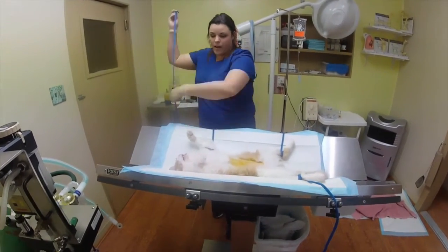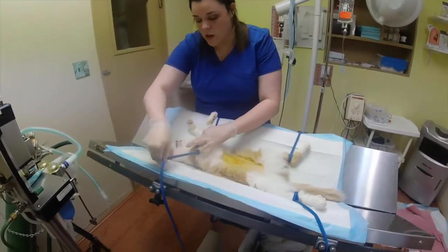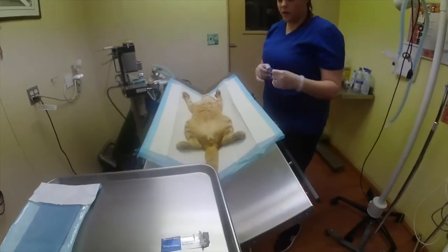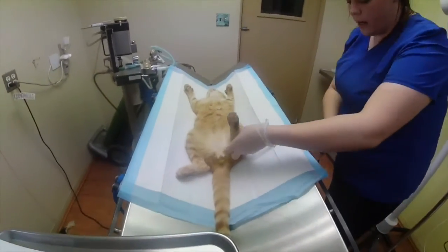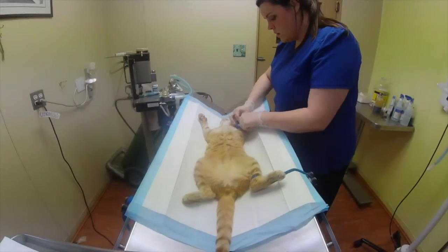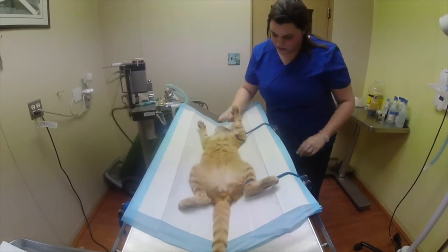Next, we will hook her to our ECG monitor, which shows her heart rate and how well she is breathing. Walking here. Okay, so now we're going to tie him in so that he doesn't leave. Go. Ah, he is a mitten kitten. Cool.